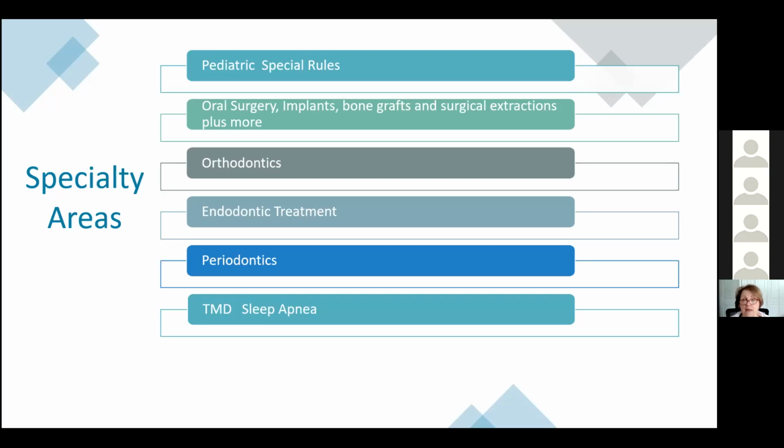And we know that perio patients lose more teeth or have more atrophy and potential loss of more teeth. So we have that responsibility. And then TMD and sleep apnea are big components right now for the use of a CBCT scan.